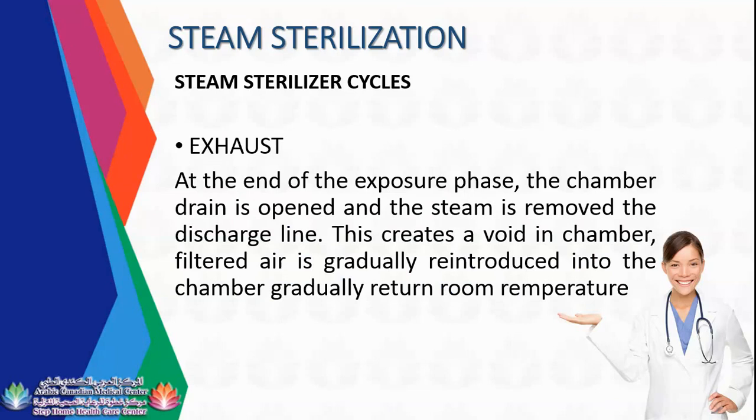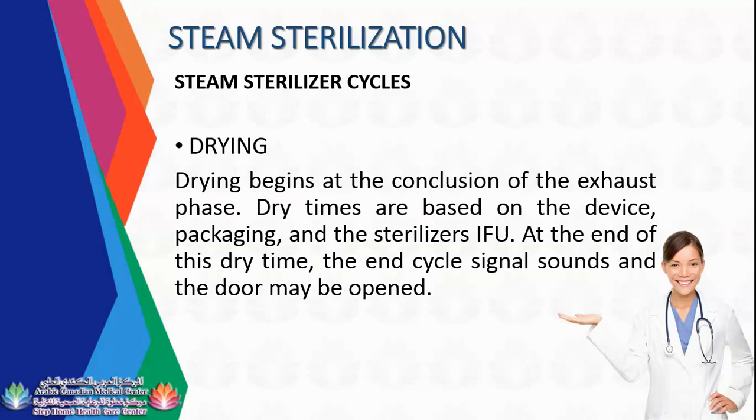Drying begins at the conclusion of the exhaust phase. Dry times are based on the device packaging and sterilizer IFU. At the end of this drying time, the end cycle signal sounds and the door may be opened. Once you open it, you need to wait at least 2 hours to remove the instruments. But safe to handle is 30 minutes. You can safely remove the instruments within 30 minutes, but in the manual, it is recommended to wait at least 2 hours to cool the instruments before removing them.